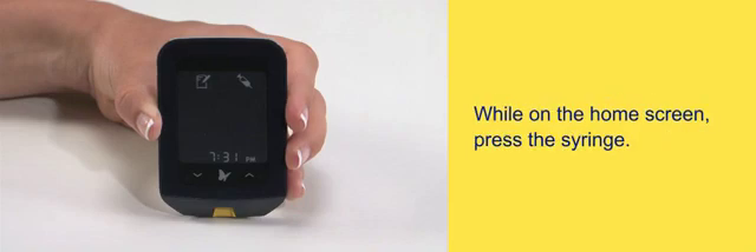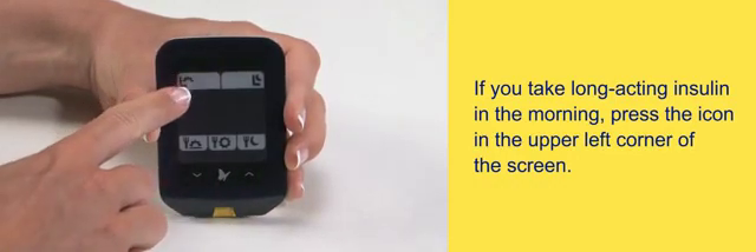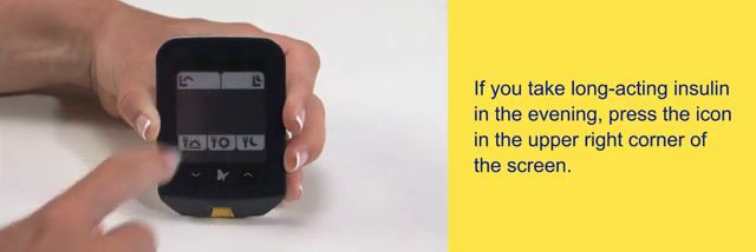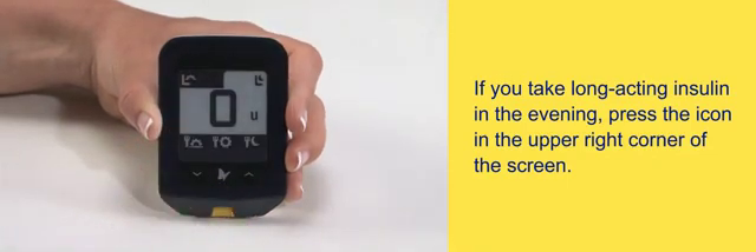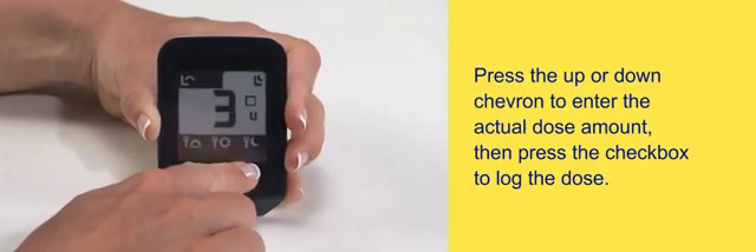While on the home screen, press the syringe. If you take long-acting insulin in the morning, press the icon in the upper left corner of the screen. If you take long-acting insulin in the evening, press the icon in the upper right corner of the screen. Press the up or down chevron to enter the actual dose amount, then press the checkbox to log the dose.